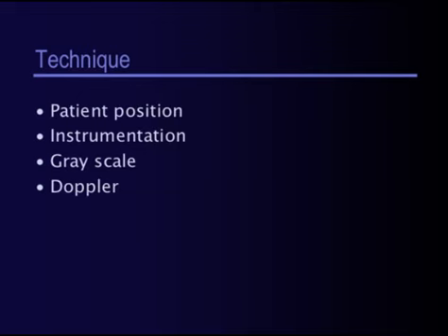We may also switch to lower frequencies for deeper structures, such as the iliac vein or the vena cava if necessary, or in larger patients. In this case, a 4 megahertz curved or sector array can be used. For grayscale, we use transverse compression, and then we can switch to color Doppler to detect non-visible thrombus. It's also good when compression could not be performed or for finding deeper vessels.